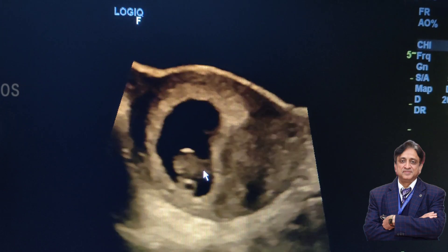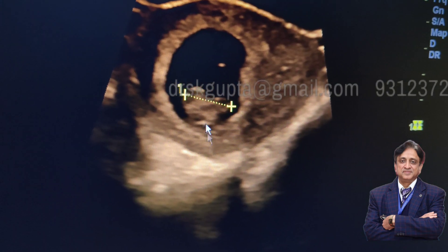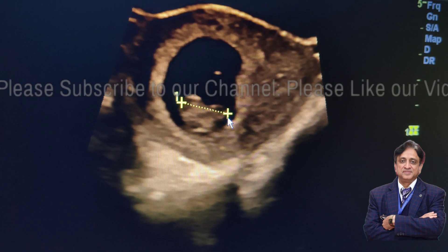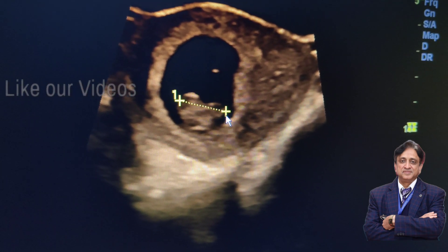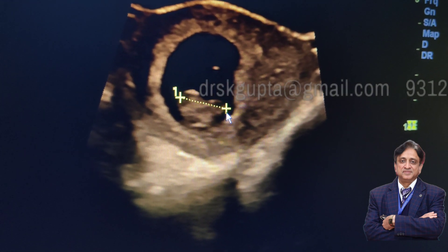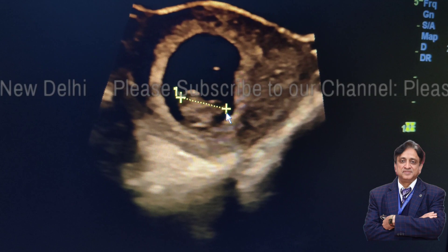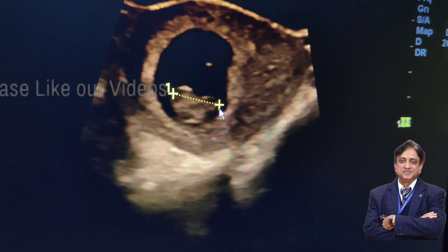Inside the fetal pole you are first likely to see the cardiac activity. But before that you should measure the crown-rump length. It is very important that you should not include the yolk sac in the measurement of the crown-rump length. Sometimes it might be difficult, especially in pregnancies of nearly 7-8 weeks of gestation, to know the exact position of the crown and the rump. A good position should be measured, and the crown-rump length is the best way to find the gestational age.